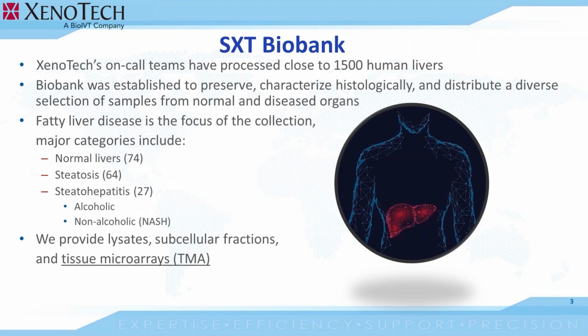From the samples gathered in the biobank, we provide lysate, subcellular fractions, and microarrays. I underline microarrays because this is the research tool that allows for utilization of spatial data and some analysis that is not possible with isolated cells or subcellular fractions.